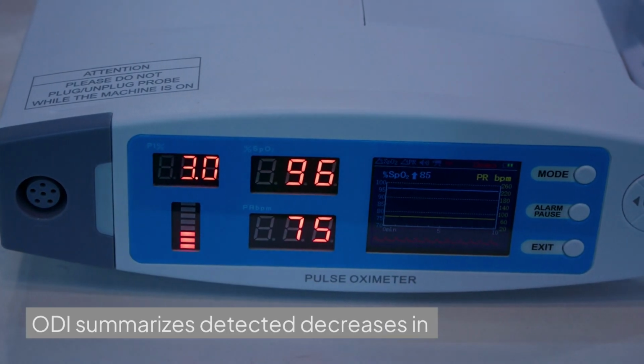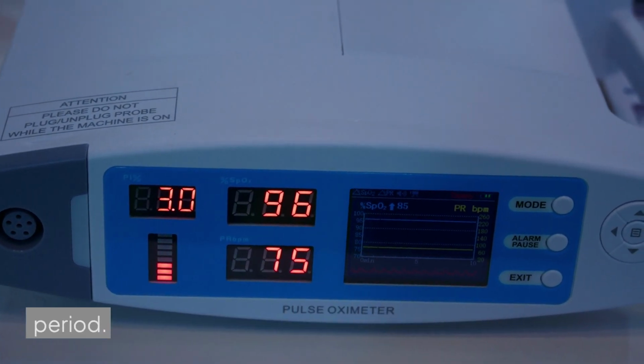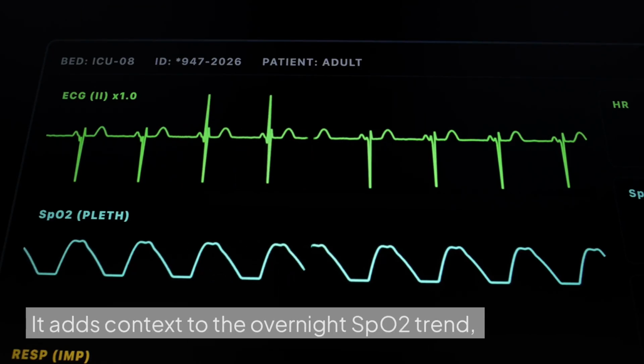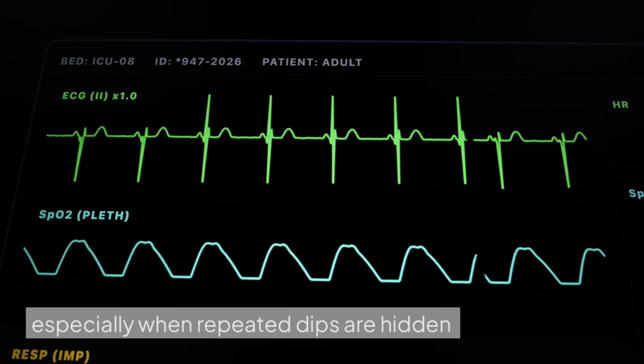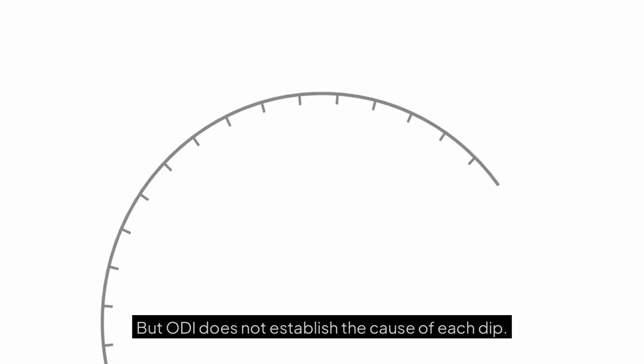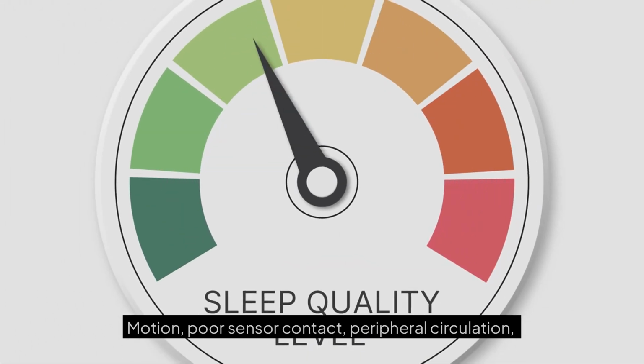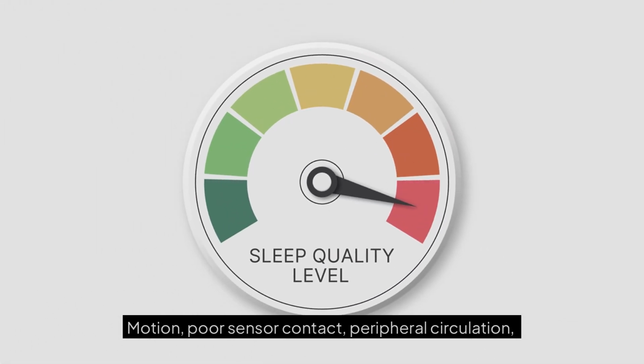ODI summarizes detected decreases in oxygen saturation during the monitoring period. It adds context to the overnight SpO2 trend, especially when repeated dips are hidden by an unremarkable average. But ODI does not establish the cause of each dip. Motion, poor sensor contact, peripheral circulation, respiratory events, and other clinical factors may influence the pattern.